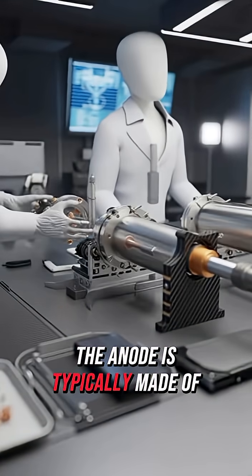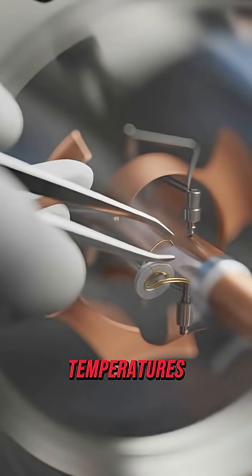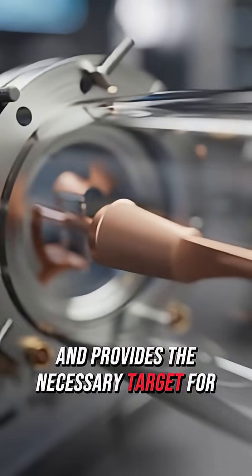The anode is typically made of a heavy metal like tungsten, because it can withstand the high temperatures and provides the necessary target for the electrons.